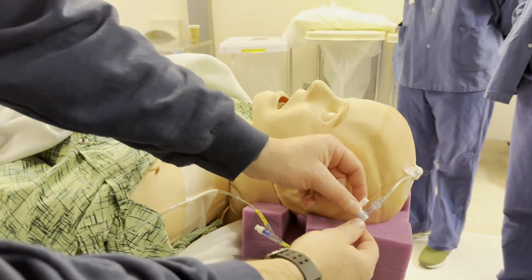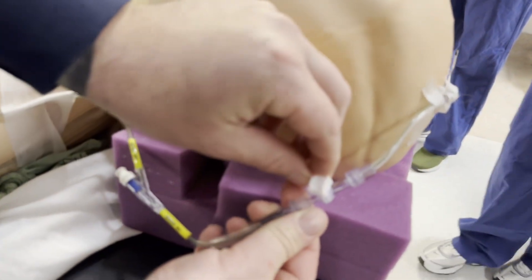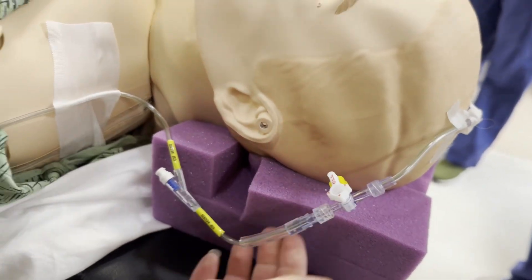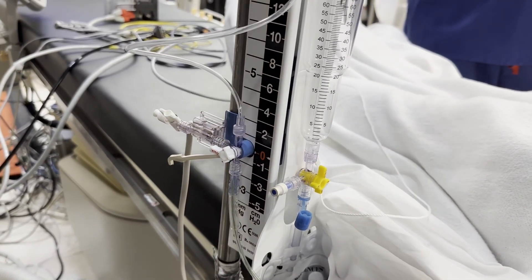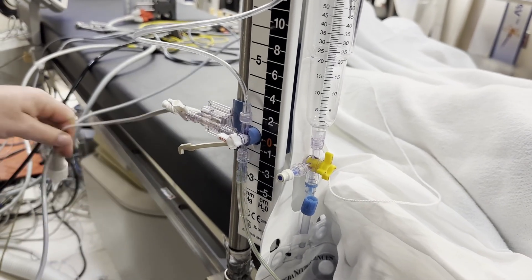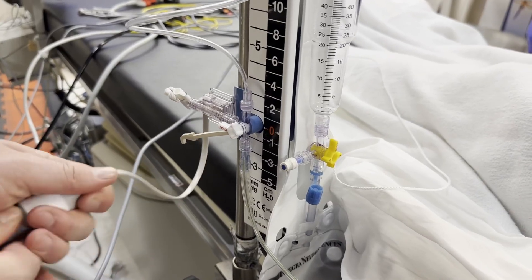Now we're going to turn it to drain. We're going to turn this stopcock here onto drain, and then make sure this one is also onto drain. Next, we're going to attach the cable to the monitor.